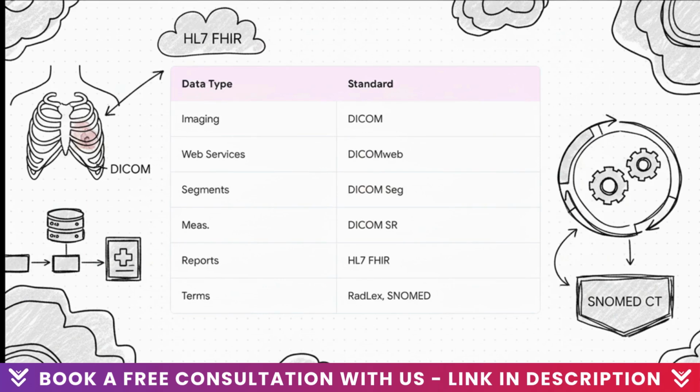You deliberately assign DICOM to imaging native data, using DICOM segmentation for lesion masks and DICOM structured reporting for quantitative measurements. And for enterprise clinical data exchange, you use HL7 FHIR to share the finalized diagnostic report straight to the EMR. And of course, the whole shebang is grounded in standardized terminology like RadLex and SNOMED CT.